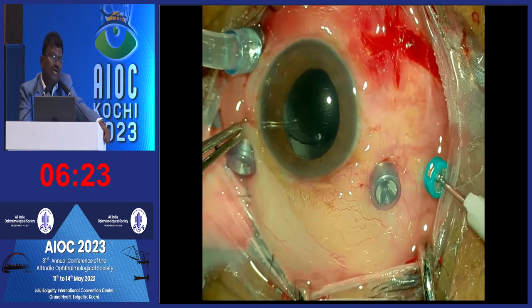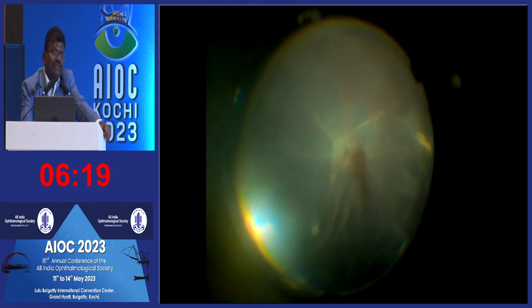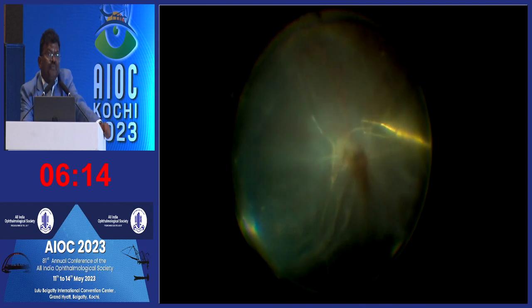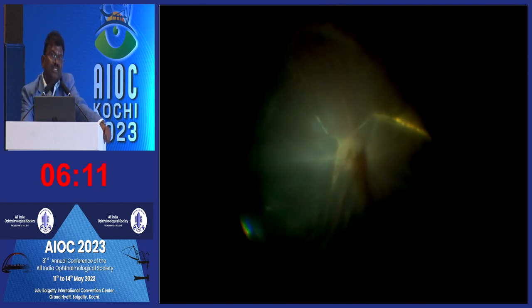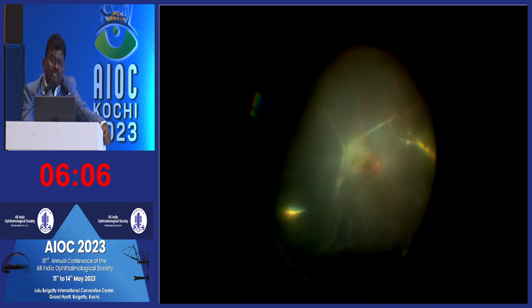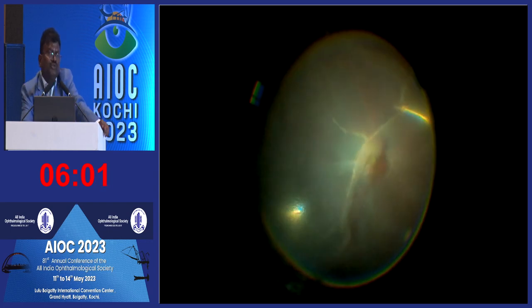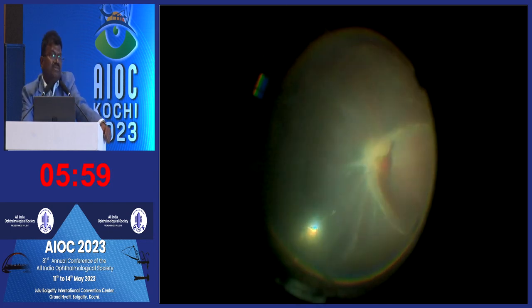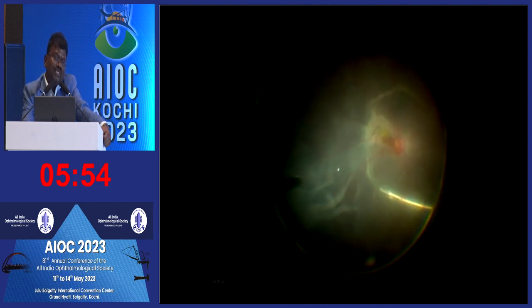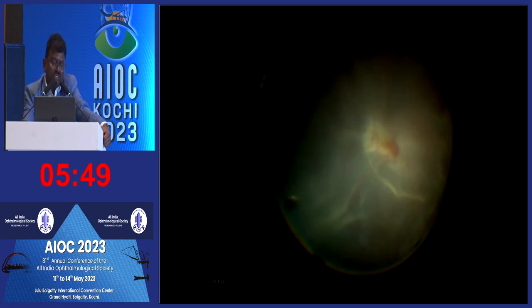Make a new port between 10 to 12 millimeters posterior to the limbus; a 25 gauge valved cannula is preferable. Insert the cannula under the retina, in the subretinal space. Use a MaxGrip forceps, engage the subretinal band, and just remove it. This is a very easy way to approach. There is no retinotomy, so migration of PFCL under the retina is mostly avoided. Even temporally, you can reach any of these areas because the forceps length is quite long.